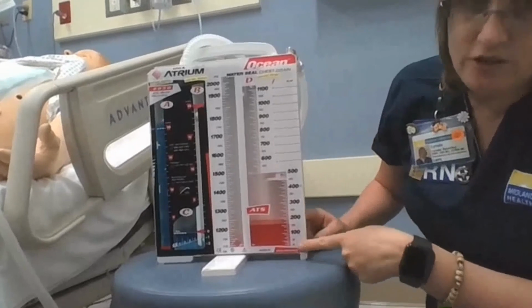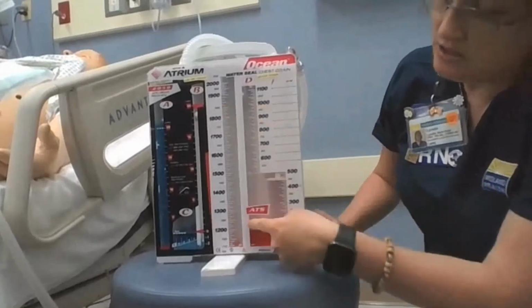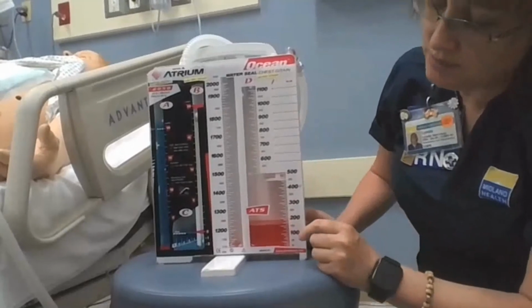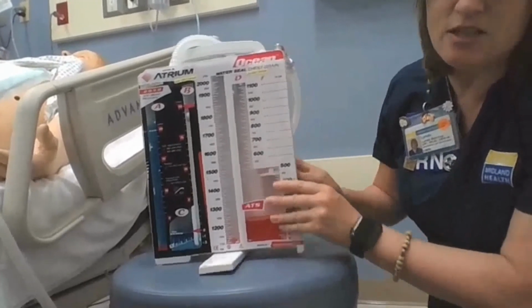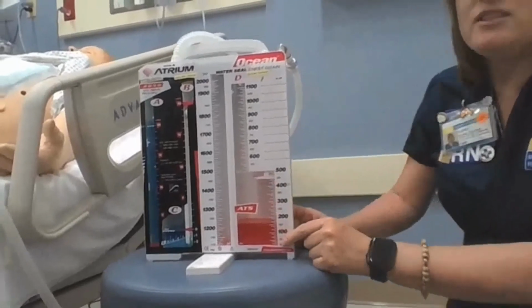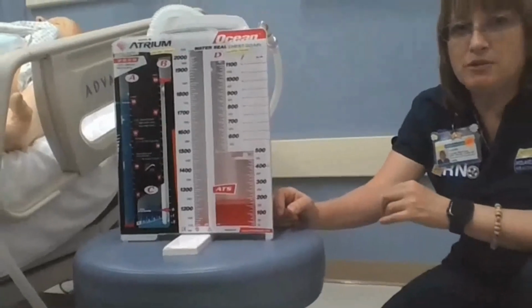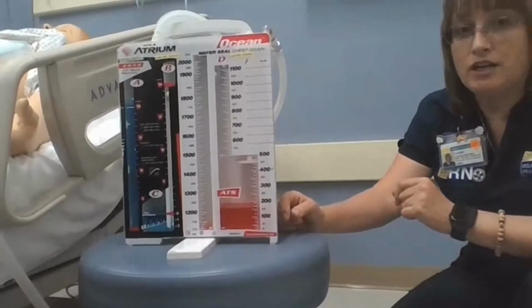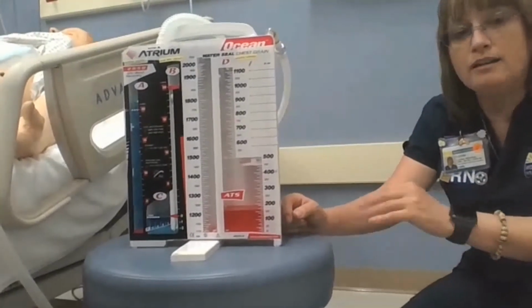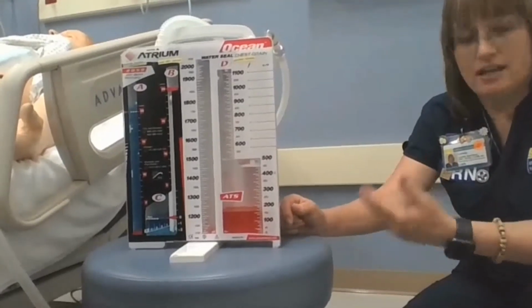And then the last thing we're going to look at is the collection chamber. So the collection chamber starts on this side. It will fill all the way up here and then overflow and start filling up this side. So this side should only be filled once this side is 100% filled. What you'll typically see though is that this side filled up and then this got knocked over, and we have some over here as well as some here. That's okay as long as you can still accurately measure how much fluid is being put out of your chest, and as long as you don't have an air leak, as long as the atrium is still intact and I can still clearly mark what line is mine versus what line was Ms. Cameron's during our shift change, then it's okay.